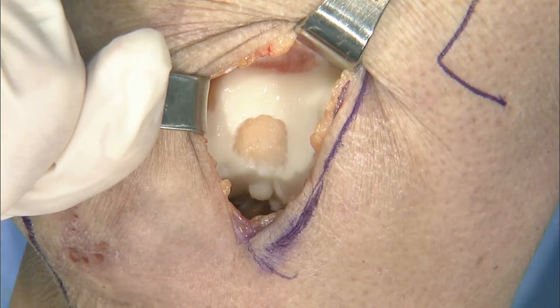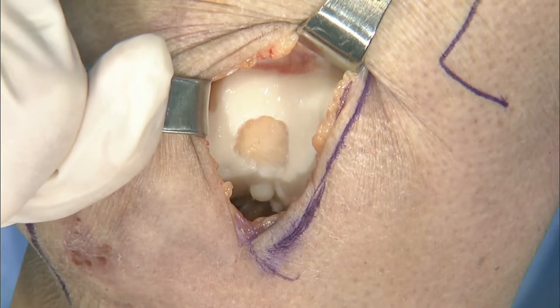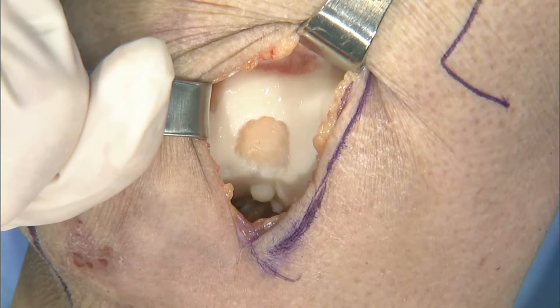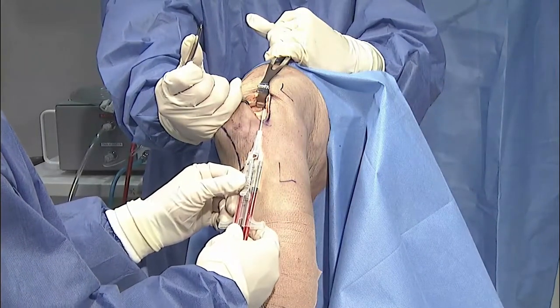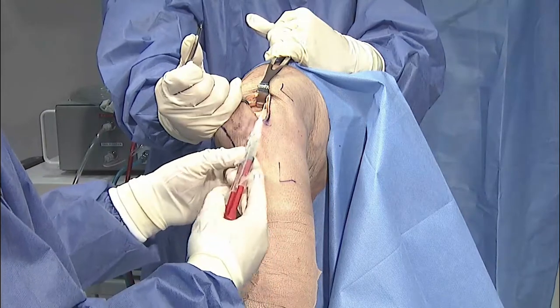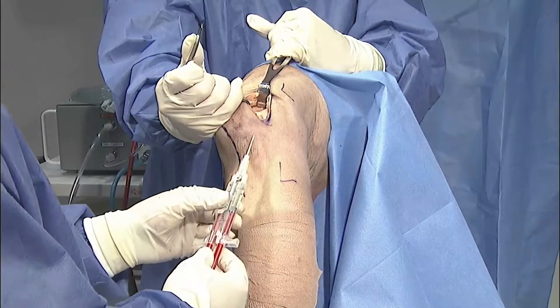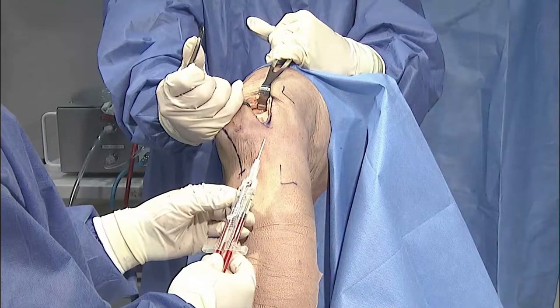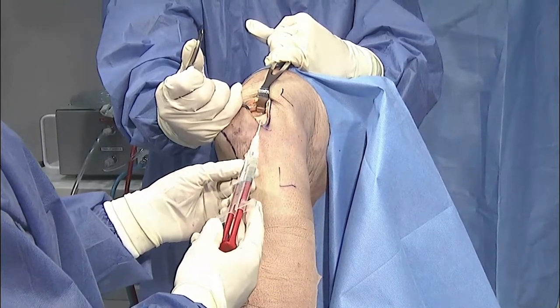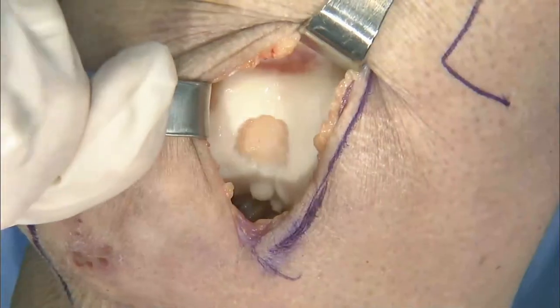So once we say, okay, my tourniquet's down, things look pretty dry, I'm happy with my defect prep, I'm ready to put my implant in place, I like how it's cut, you then take the fibrin glue that's here. Again, you want to be pretty minimal with this. You come back into the knee, and this is one of the big differences: you're putting that fibrin glue down first. There are some white paper studies that show that cartilage cells like fibrin glue. They tend to be a little bit more viable and a little bit happier in it. So you put that against the subchondral bone when we come back into the knee.